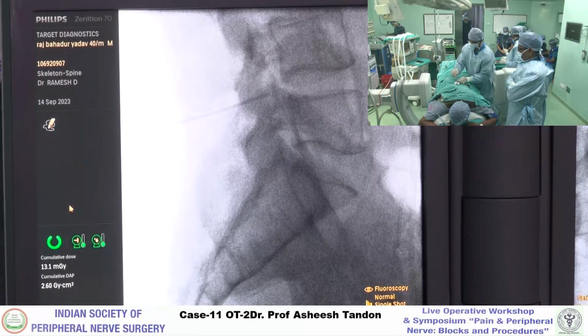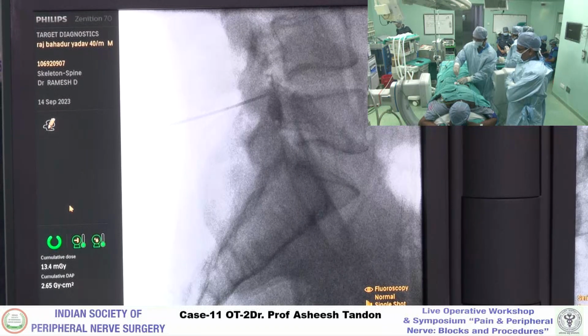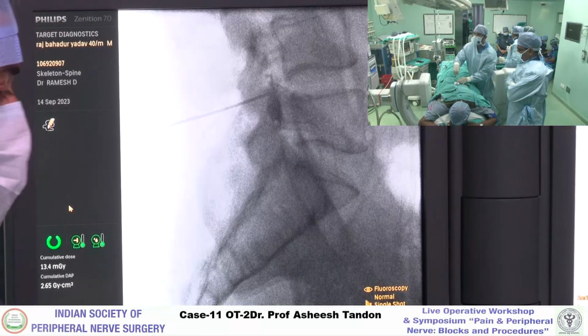Yeah, we were touching it on one side. Shoot please. Okay, shoot please.